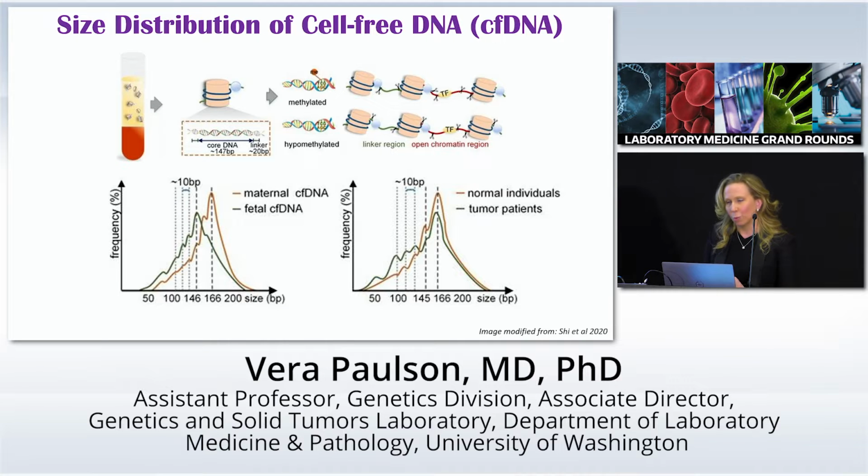As it turns out, and we won't discuss this too in depth, but we actually think the way that we're isolating these fragments have skewed our understanding a bit as to what their actual size is.